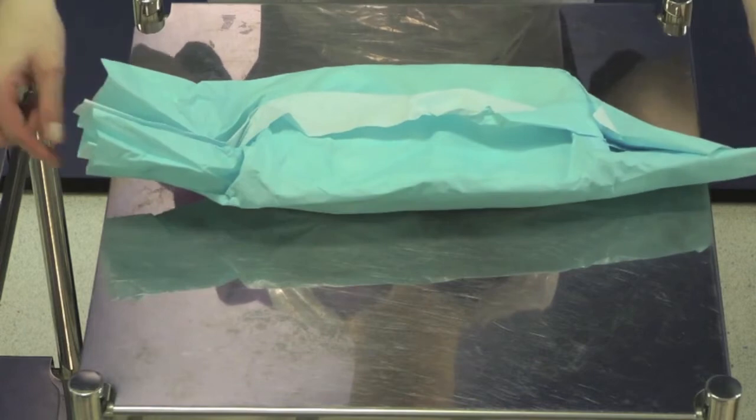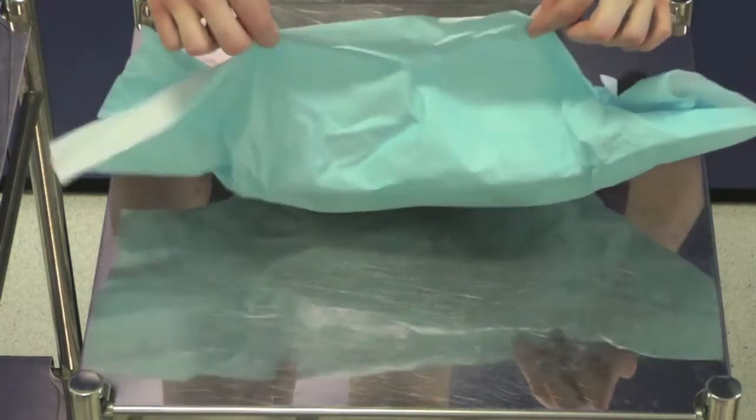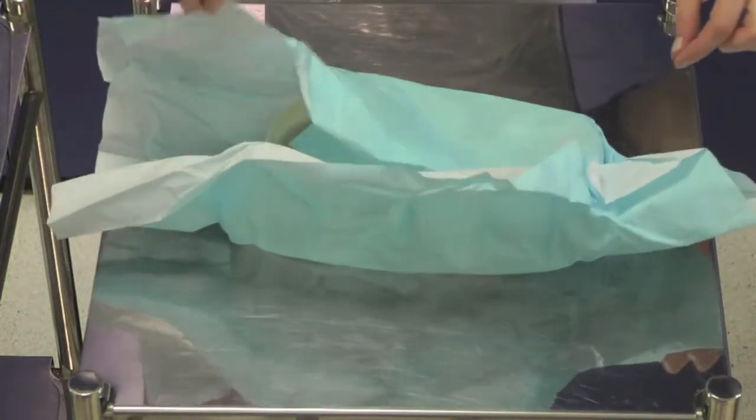Carefully open up the sterile catheter pack. You should open the pack away from you first of all.